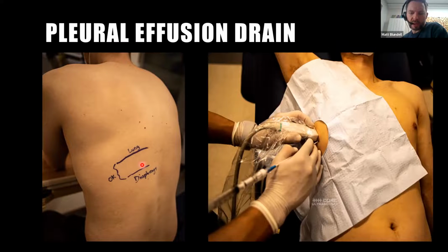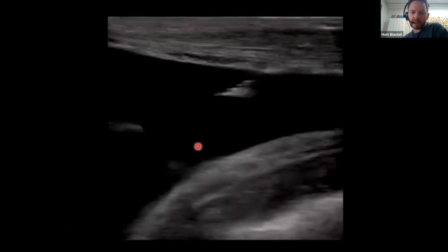This is using ultrasound to visualize the needle going into the chest wall in a live process. People used to be a bit more apprehensive about doing this, but I think now we're using ultrasound a lot more for vascular access. People are a lot more happy using ultrasound to do procedures, especially things like nerve blocks. It's a very similar technique. So you're going to be using a linear probe again, and you'll be using your chest drain. Obviously, you're going to be fully aseptic with a probe cover on, and this is what you should see.